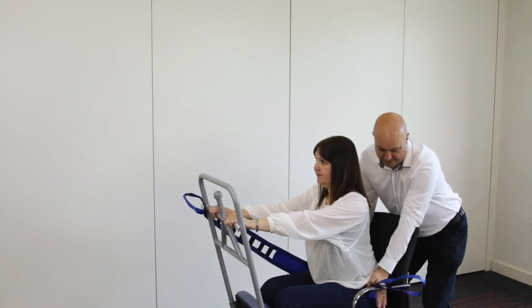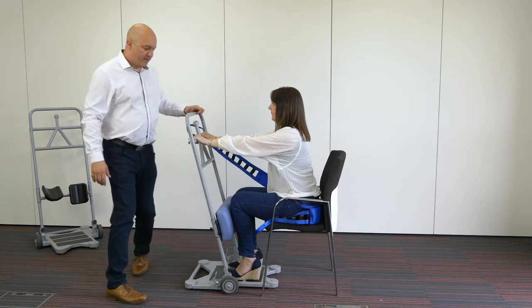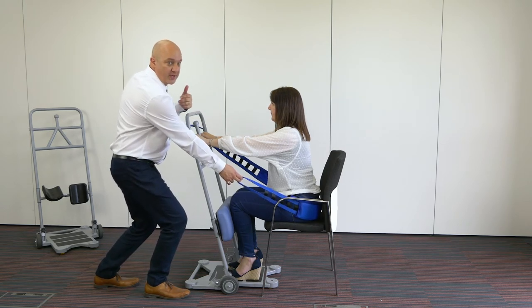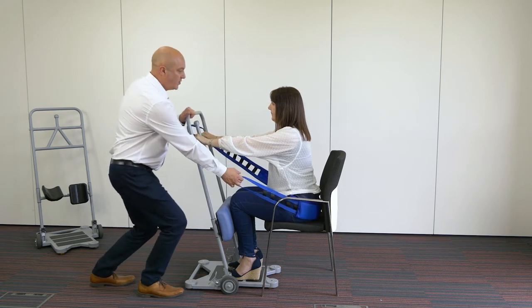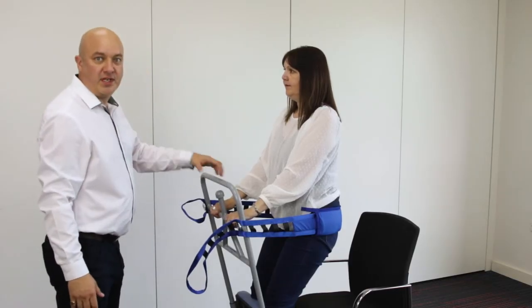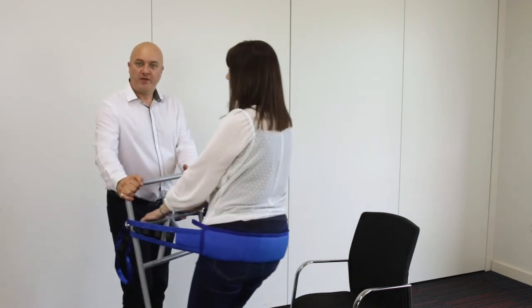I'll pop the sleeve behind Sarah's bottom — but not physically under the bottom. This manoeuvre is about bringing the hips forward, not lifting the bottom off the chair. Coming back around in a good position, counterbalancing with my left hand, I take hold of the handle and encourage Sarah's hips to move forward as she tries to stand. Once she starts to stand I pull back on this and lock it in position. She's then locked in position and we can take the brakes off and move her from one piece of equipment to another.